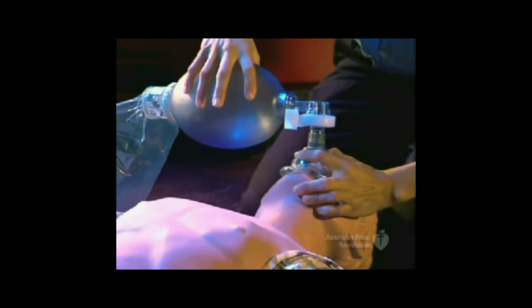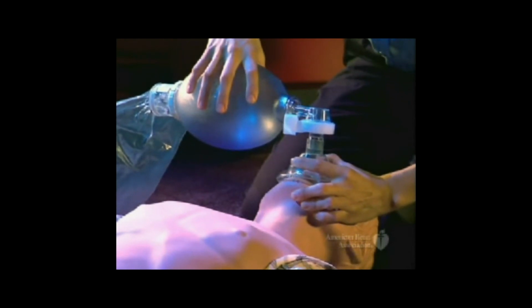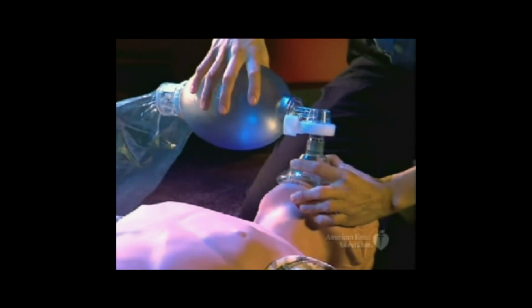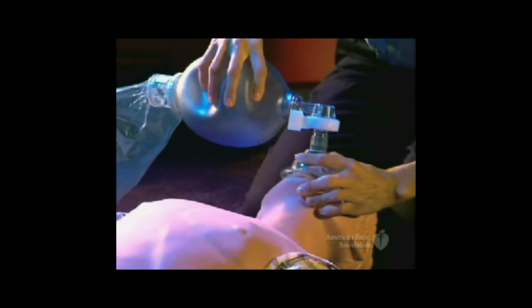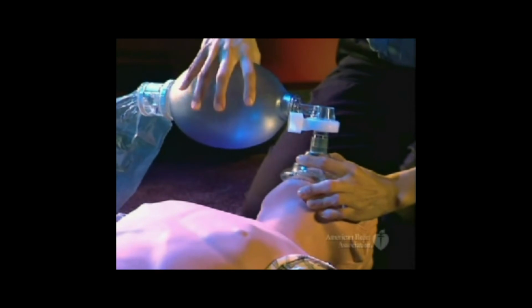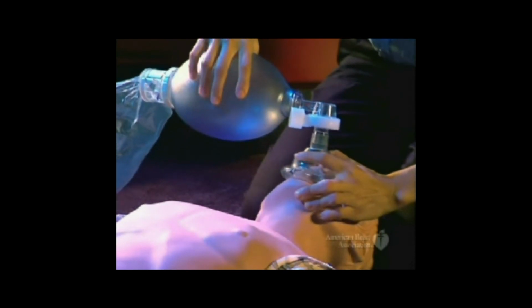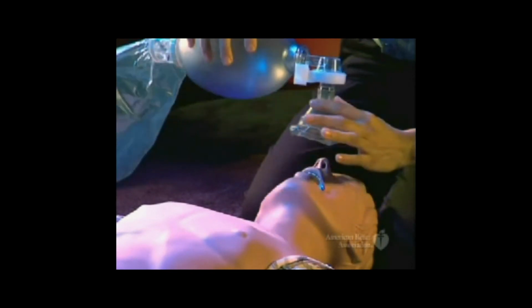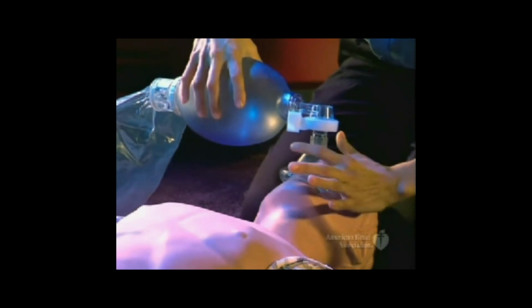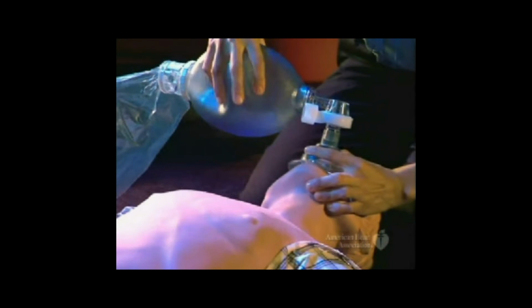the airway. Make sure you squeeze the mask with your thumb and the heel of your hands while lifting the jaw to achieve an airtight seal. Squeeze the bag with your other hand or push it against your leg or body. If the chest doesn't rise, then you are not providing adequate breaths. Adjust the mask, reposition the head and neck, or administer a larger amount of air. With or without supplementary oxygen, give one breath every 5 to 6 seconds. Practice this now for 1 minute.